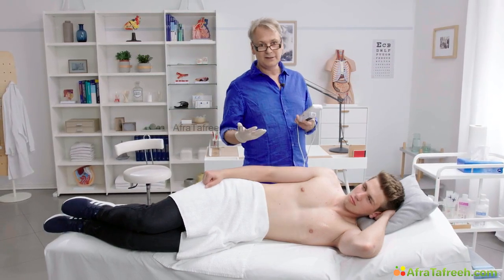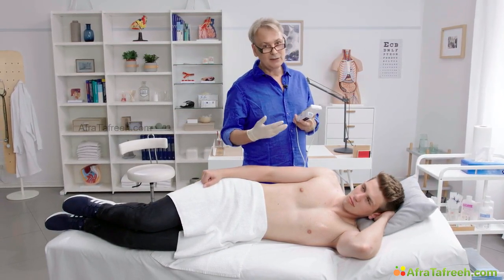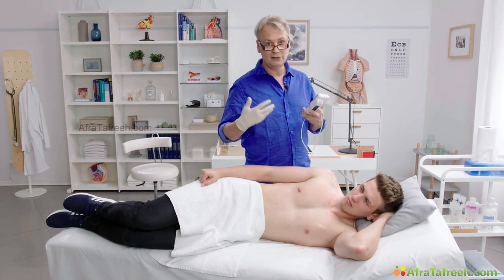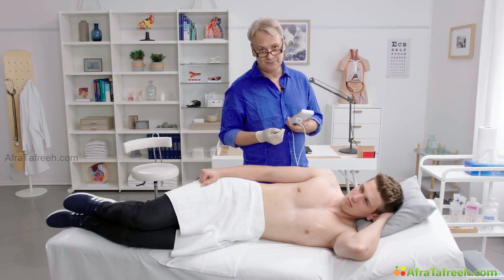In obese patients or in patients who have some thorax abnormality, the apex can be located very differently though. It can be more lateral or sometimes even pointing to the back. So you have to look for the position of the apex, but you can also do that with your transducer.